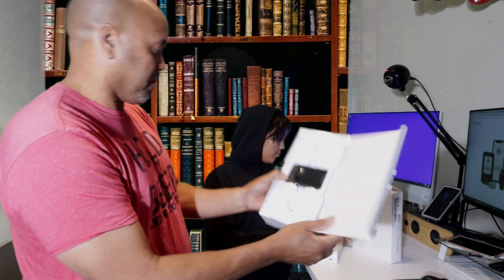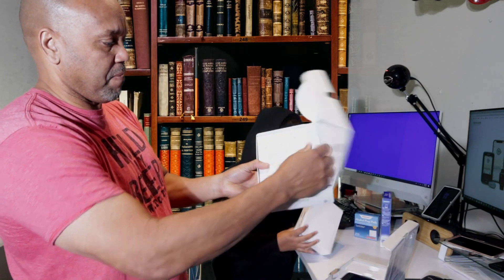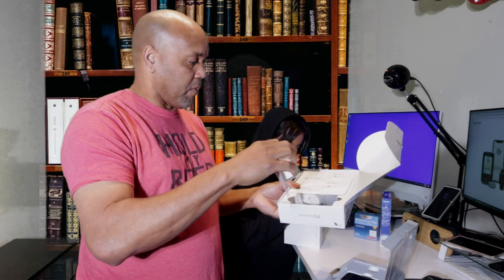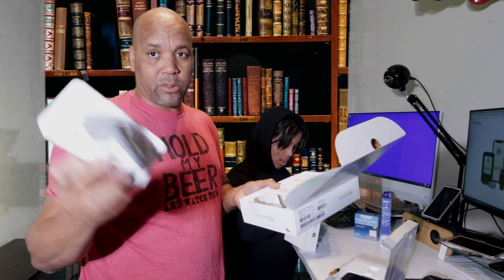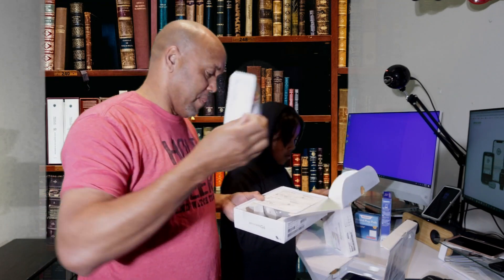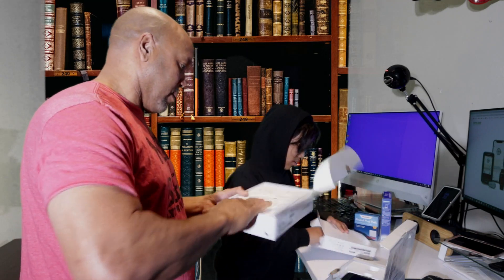So here we have the receiver, we have three sensors, and they come with the machine. Each one lasts 10 days, so three sensors gives you about one month of supply.